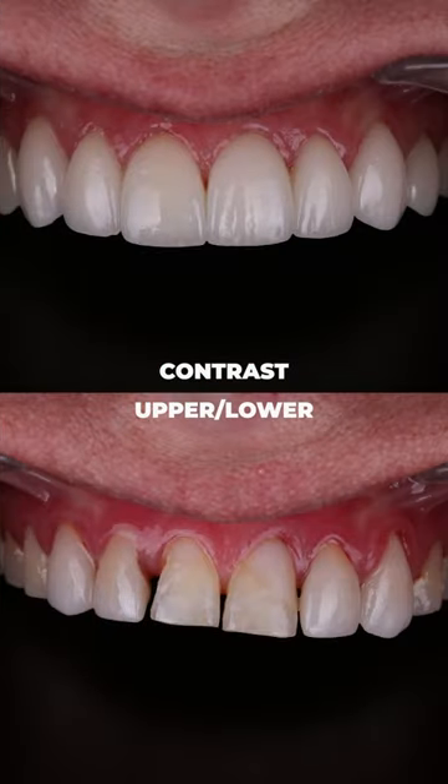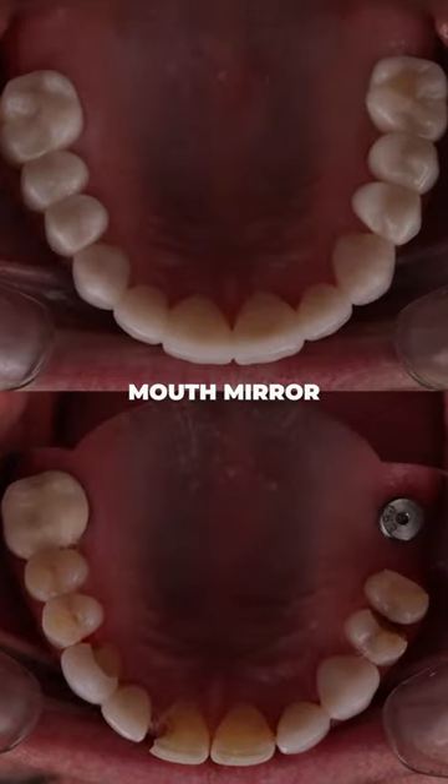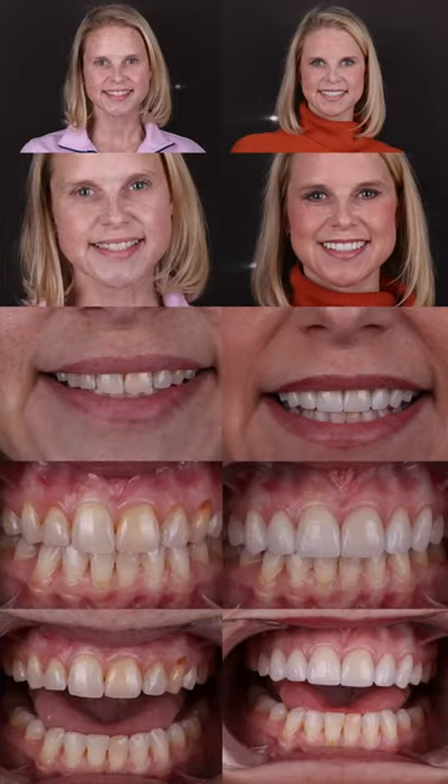Then we do contrast of the upper teeth or contrast of lowers. If we're doing different things, we'll shoot mirror images of the arches so that we can get the full arch and really get the characterization of those teeth, so that we can communicate to the lab effectively the characterizations we want to see if we're trying to match something in that set of teeth.